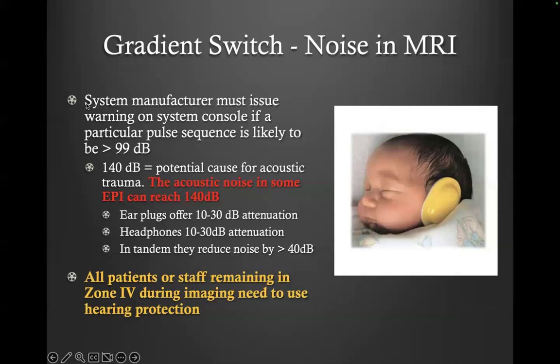This noise is caused by switching the gradient. When you switch the gradient, it causes a torque on these electric wires, and when they have torque, they move. But they are all in a plastic shell of coils in the scanner, so the wires try to torque and hit their housing. So anytime you have an imaging sequence running, you're going to hear this loud banging noise. And when a sequence ends and there's no gradient switching, the noise will end.